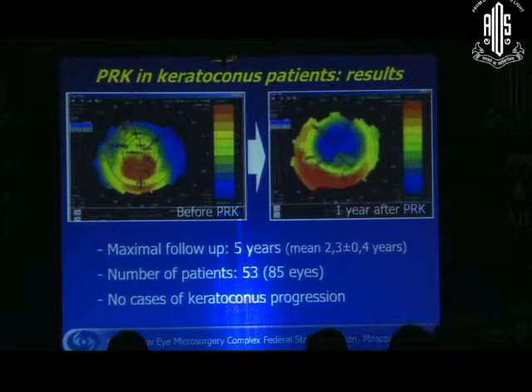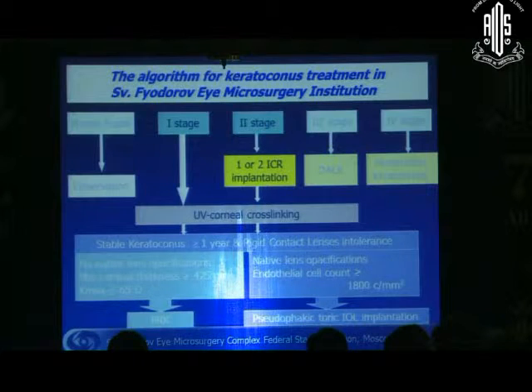For this period, we operated about 85 eyes, and the maximal follow-up period is 5 years, and no cases of keratoconus progression have been detected. In case of native lens opacification, we perform pseudophakic toric IOL implantation.